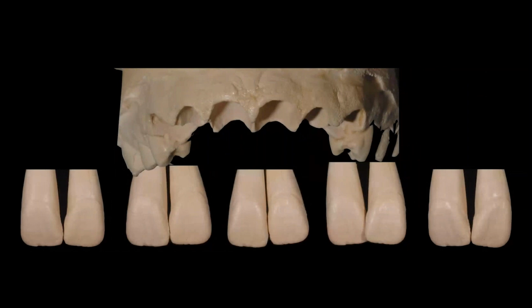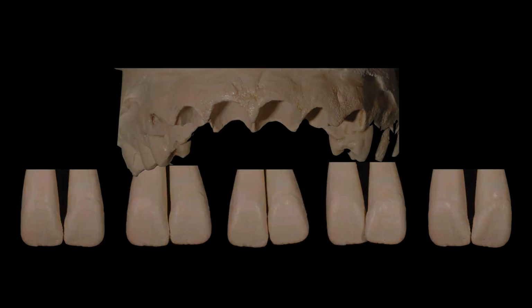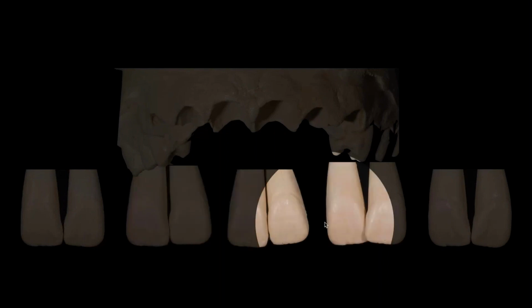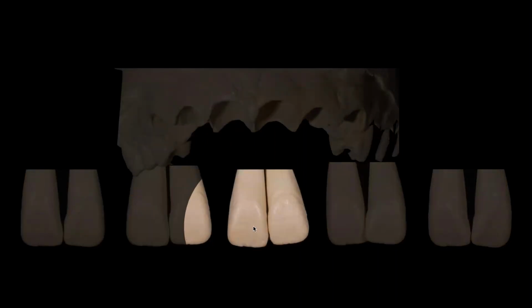Another great exercise that I've taught a lot over the years, especially in hands-on courses, is sometimes when you find teeth you like, duplicate the model and make the teeth removable so I can actually take them out and have sets of teeth. And I could set them up on Play-Doh, or I could set them up in a way where I can actually look at them and see what they look like when I just put them next to each other. Or what if I overlap or change the angulations a little bit and see how much different the light reflection looks based on one tooth position being different, but also how much more or less embrasure space I may have depending on the angulation of the root or how I put those in.